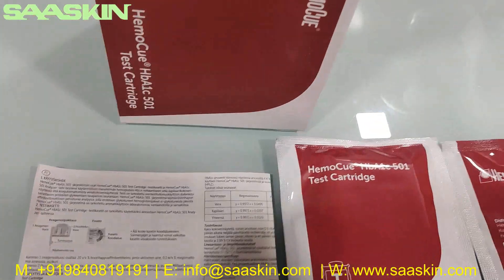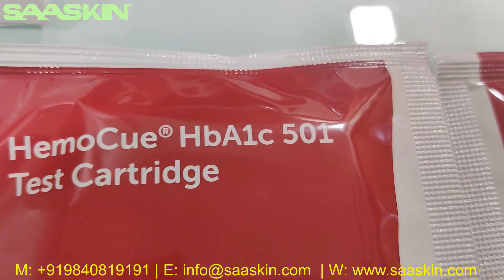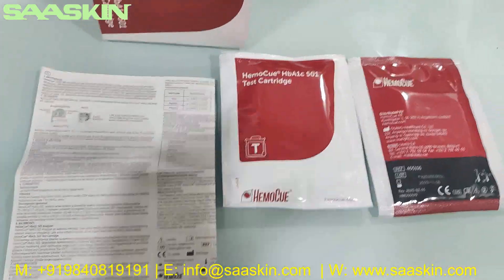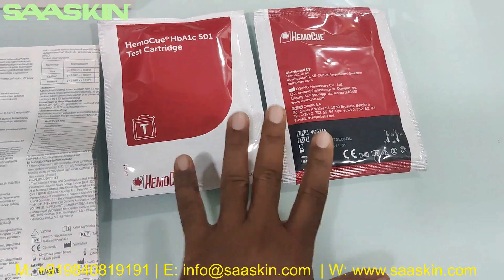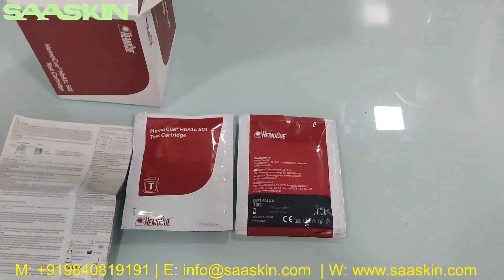Just to quickly tell you — for the EmoQ HbA1c 10 Test Kit Pack, this is what the box looks like. You have 10 test cartridges pack like this, and you have an IFU brochure.